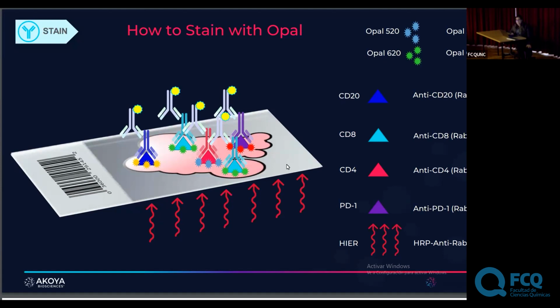And how long does the incubation period take? Antibody incubation, I believe, is about 3 hours.